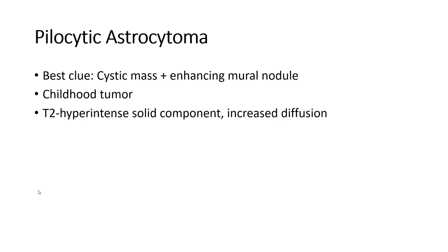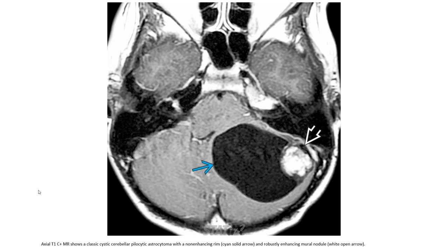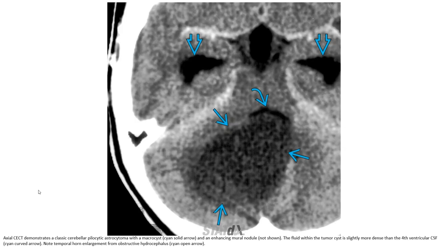Pilocytic astrocytoma presents as a cystic mass with an enhancing mural nodule. It is a childhood tumor with T2 hyperintense solid component and increased diffusion. On axial T1C+ imaging, a classic cystic cerebellar pilocytic astrocytoma is seen with a non-enhancing rim and a robustly enhancing mural nodule, indicated by the solid and open arrows respectively.